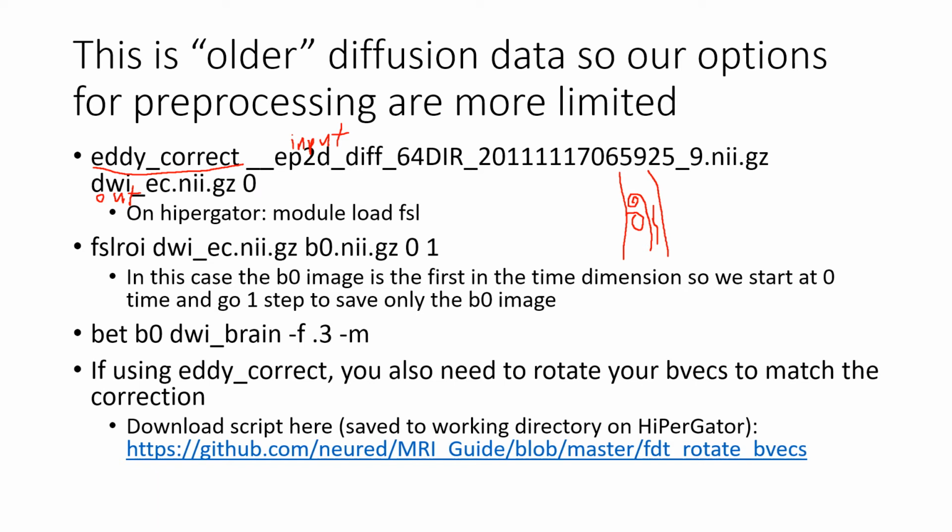And so what this means is this diffusion scan, we use it for structural information about the brain. What does the white matter look like? Can we see these pathways, these major tracks in the brain? So we use it for that, but it's acquired kind of like a functional MRI. That means you're getting one picture of the brain, and there are multiple slices.